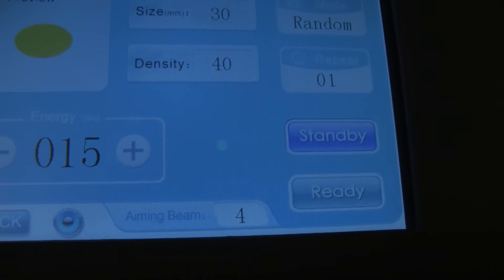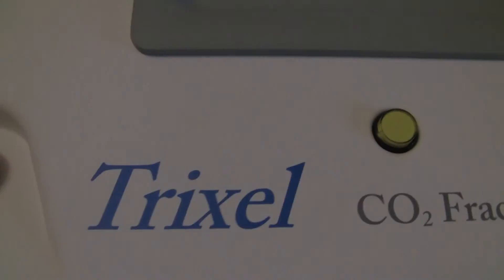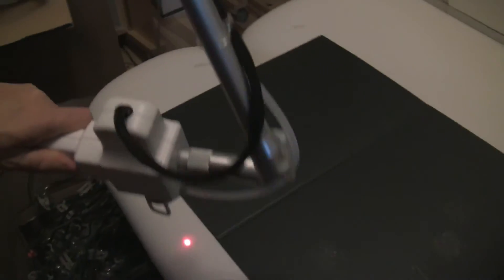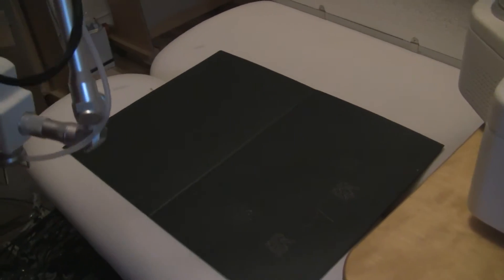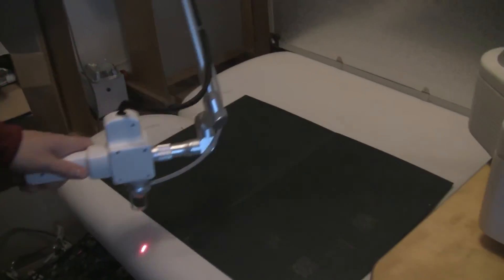Let's go ahead and take a look at the scanner. We're still in standby mode, but here is the scanner. As you can see, it can be swiveled at any position. This articulating arm is very nice — it swivels in about any position you need it to go in.